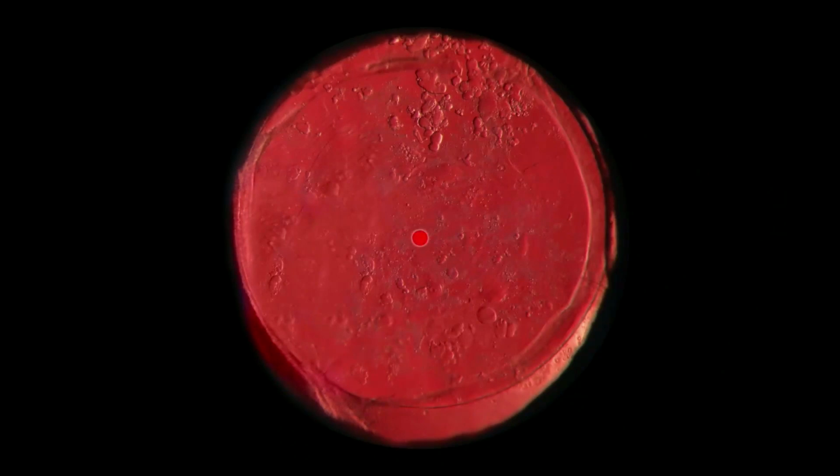Here you can see the aiming beams in focus directly on the capsule. They are overlapping, forming one circle. Now pushing the focus about 1.5 millimeters further posterior behind the lens into the vitreous. Two red aiming beams are now clearly visible on the posterior capsule.